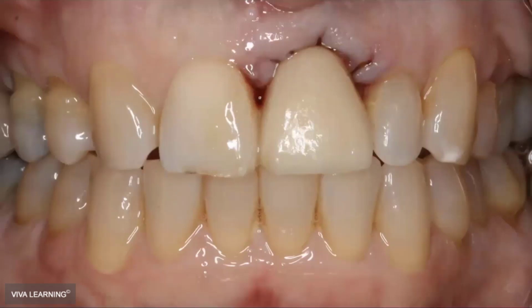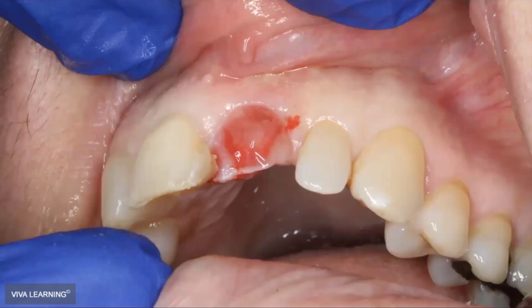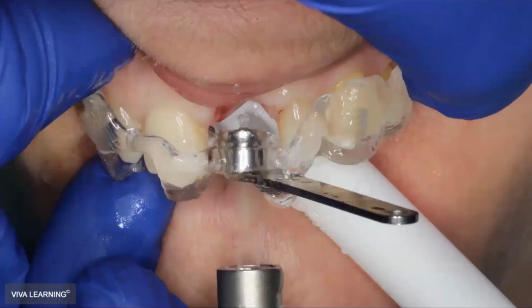But that's the same day post-op for her. And this, I like to joke, is the world's smallest retainer for a Maryland bridge, but her occlusion supported it. And this same Maryland bridge was used multiple times on her between steps, because the next step is to see her in 3 to 4 months to remove that Maryland bridge by wiggling it for 3 to 4 minutes and seeing a nice soft tissue space that we maintained.